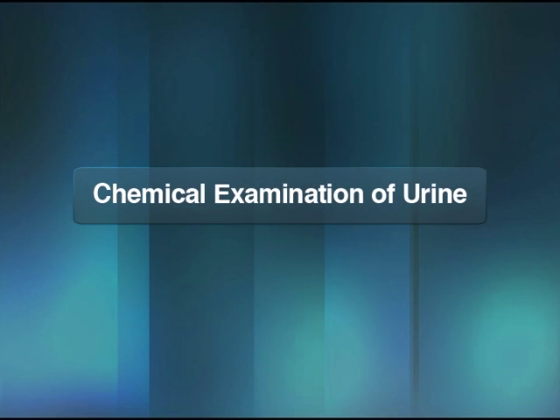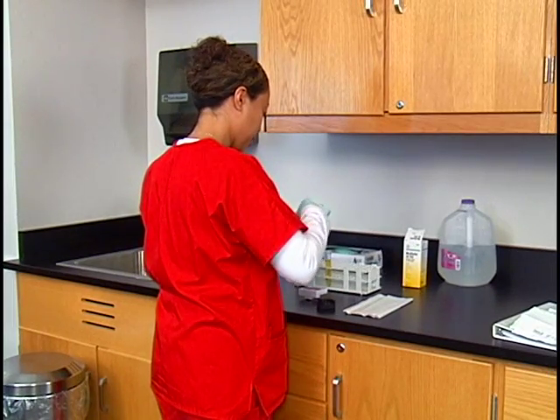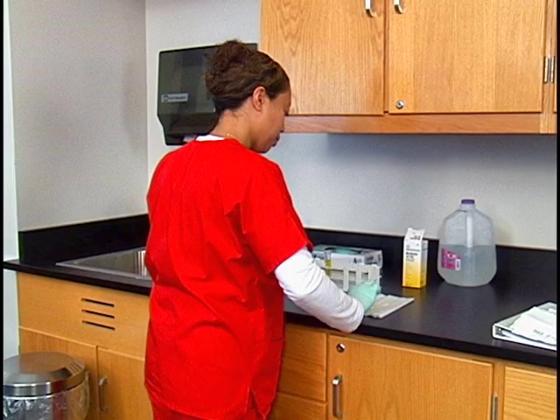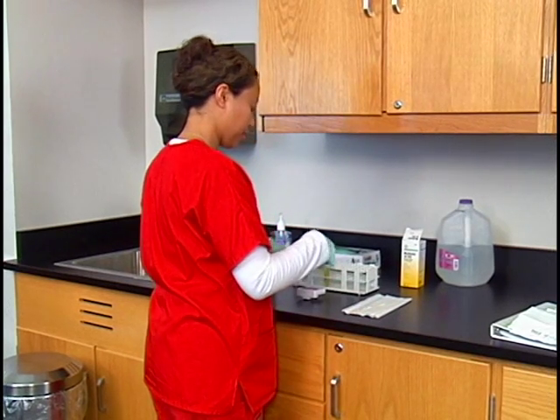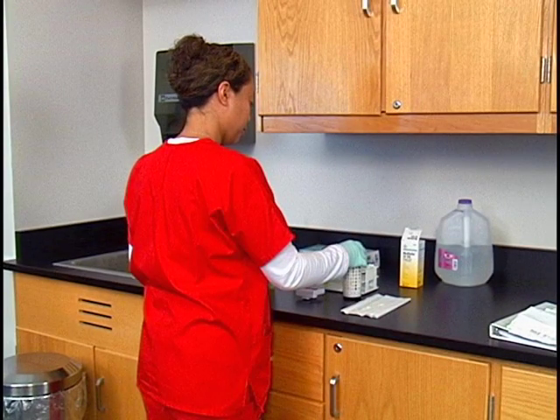Next, the chemical examination of the urine specimen is performed. Remove a reagent strip from the plastic container. Do not touch the reagent areas with your fingers or lay the reagent strip on the table. If you need to put the strip down, you can lay it on a clean, dry paper towel. Recap the container immediately to prevent exposing the strips to moisture, light, and heat. These factors can alter the reaction of the chemical reagents on the strips, leading to inaccurate test results.